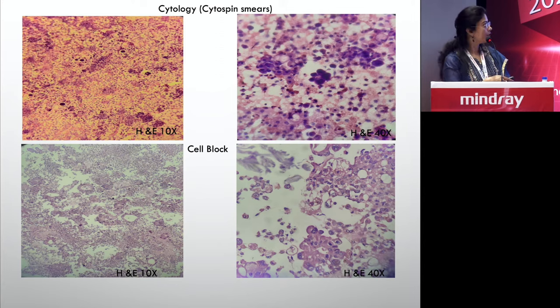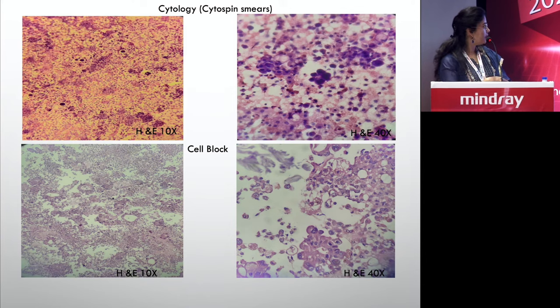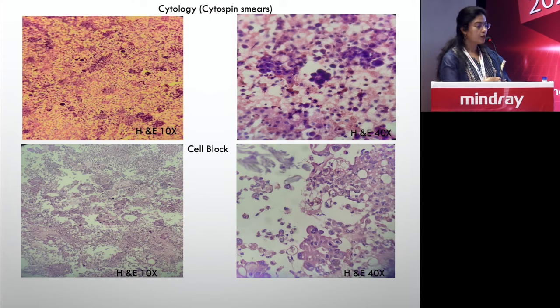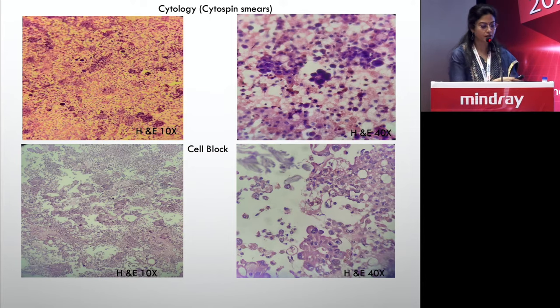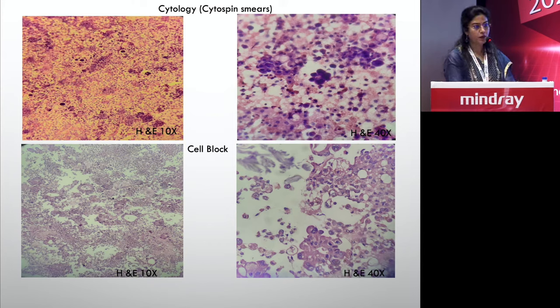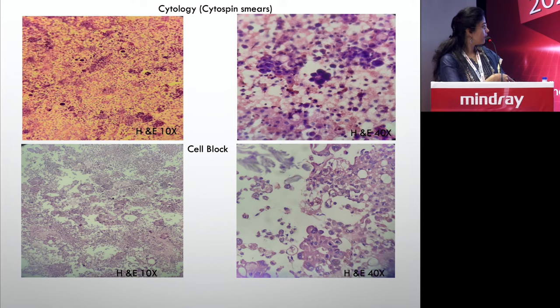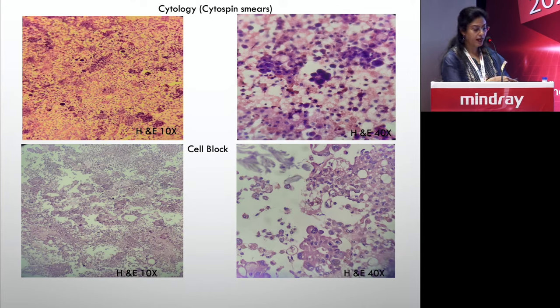Sometimes on a cytosmear we are not very definitive to categorize cells as malignant, so we take a cell block as the gold standard. Good cell block evaluation depends on how much fluid is received and how well it is mixed and processed, particularly for volumes over 100 ml. In our institute, we make at least one cell block per 50 ml — for one litre, we may make 8–10 cell blocks to improve yield. This cell block showed a sinusoidal pattern with high N:C ratio and clumped chromatin, favoring a malignant effusion. The case was positive for atypical cells and the instrument had also picked up these cells.